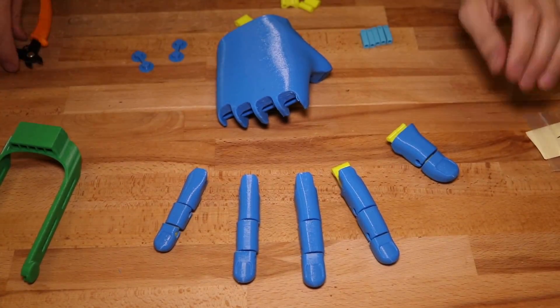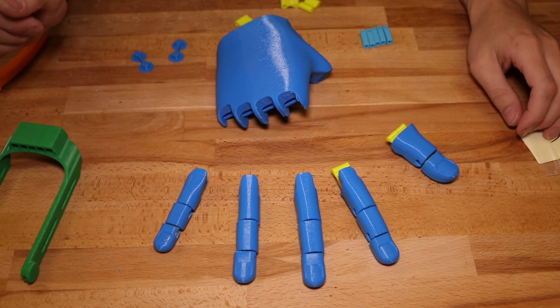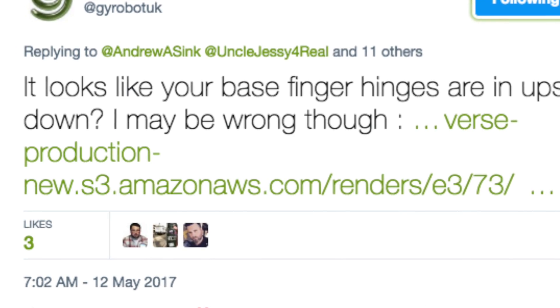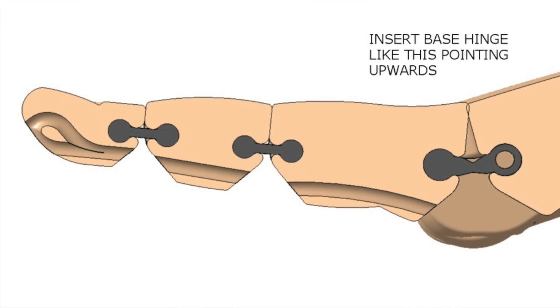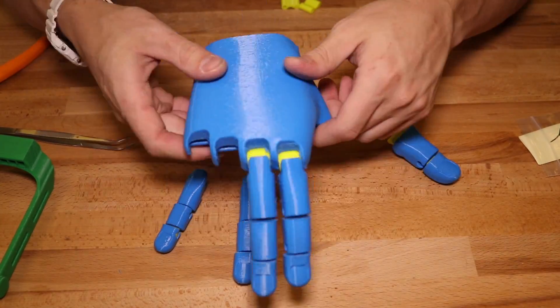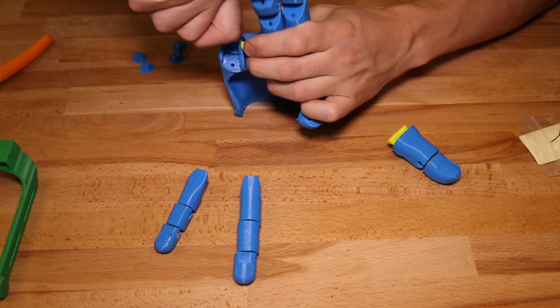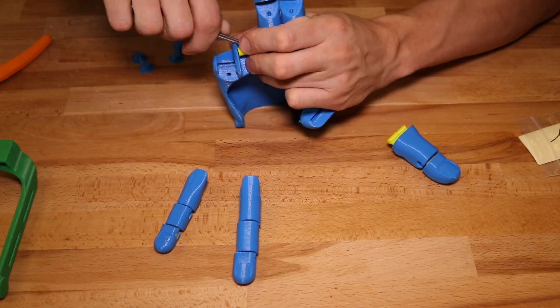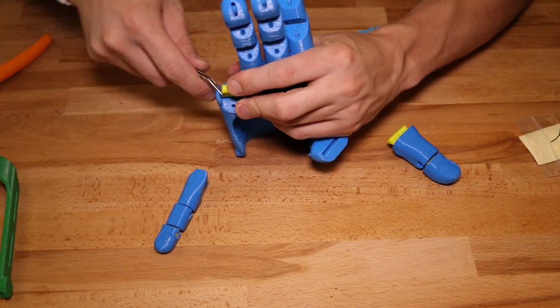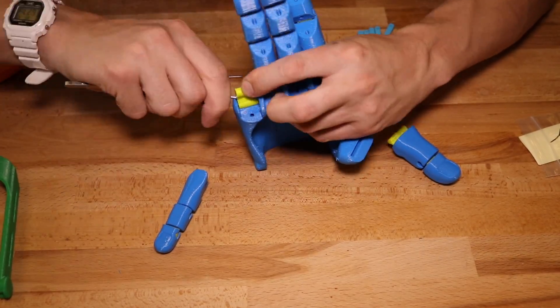Once the fingers are assembled, it's time to attach them to the palm using the large finger joints. When I posted a picture of the work in progress, Gyrobot was kind enough to point out I had installed the hinges upside down, so you'll notice the fingers have kind of a downward tilt — that was corrected after I uninstalled the hinges and flipped them. So when you install them, you want them to be pointing upwards as seen in the diagram.